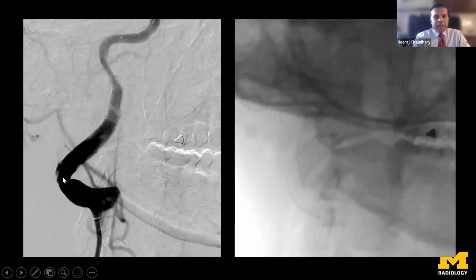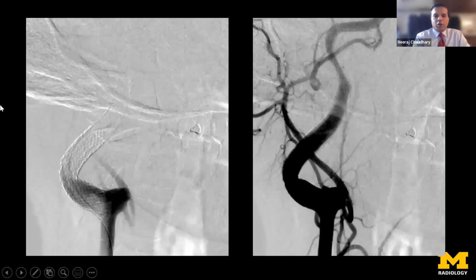a couple of telescoped stents, and we have in our midst a giant in stent applications. Dr. Jameri, my senior colleague, does body intervention and neuro intervention. He knows stents like the back of his hand, so we were collaborating on this case. We put in a couple of telescoped stents, as we see on this image, and we restored flow. So the dissection flap is tacked down onto the vessel wall. You can see some irregularities still here at the back, but the vessel is largely opened up compared to what it was before. And this is another image showing the flow to be better.